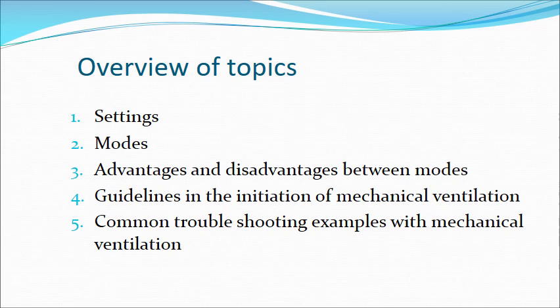examples with mechanical ventilation. Now we'll start with this warning that you as a biomedical technician or engineer should never recommend settings to a clinician. That is not your job. Your job is to understand the settings and the modes so that you can test their proper operation only. There is a temptation to respond if a staff member asks you, "Where should I set the alarms?" That is not your role.